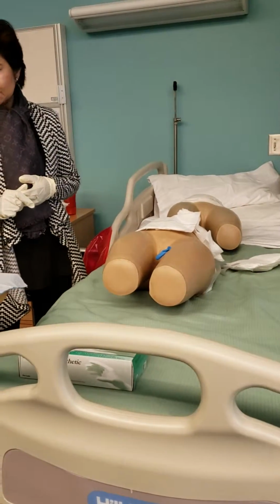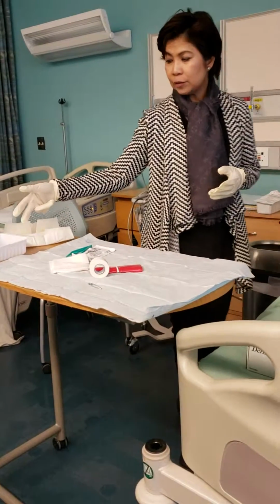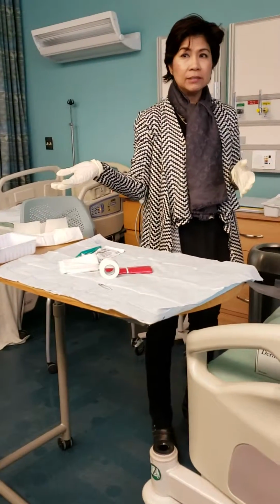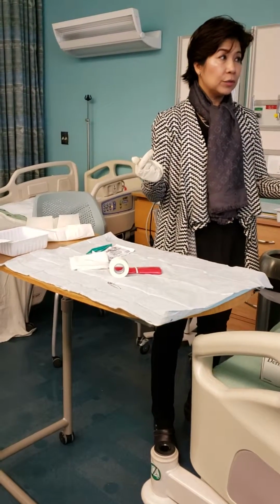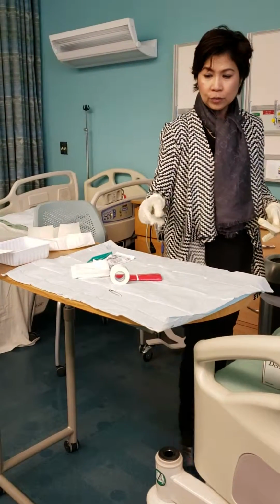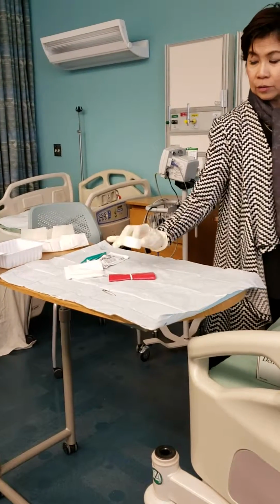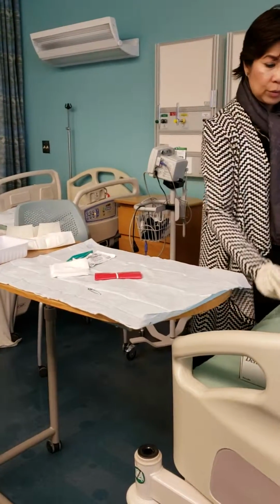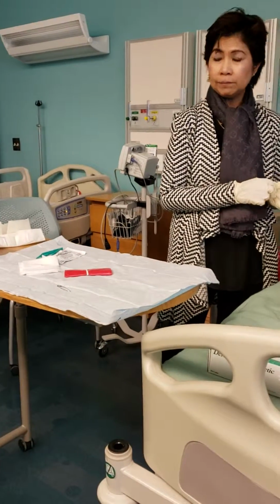Why? Because your tray, especially this one, only has the plastic tape. What if your patient is allergic to the plastic tape, but you got the paper tape from the supply room? So this one you can do clean gloving.